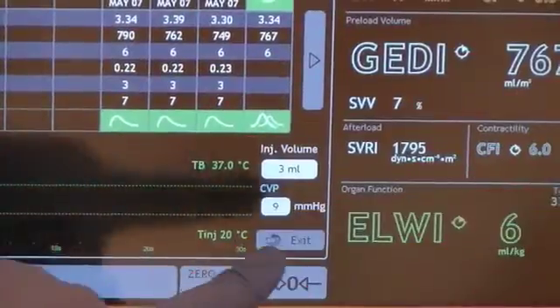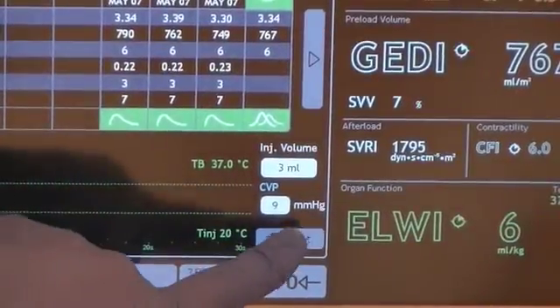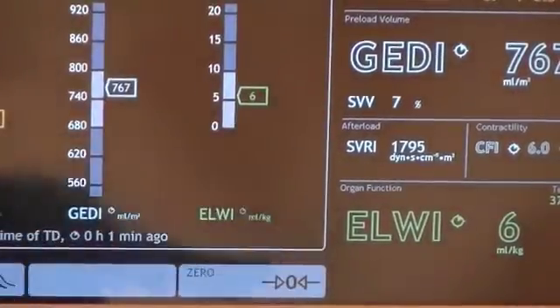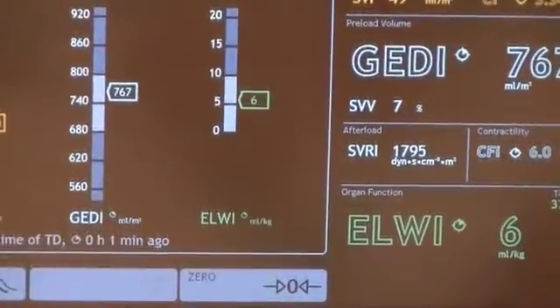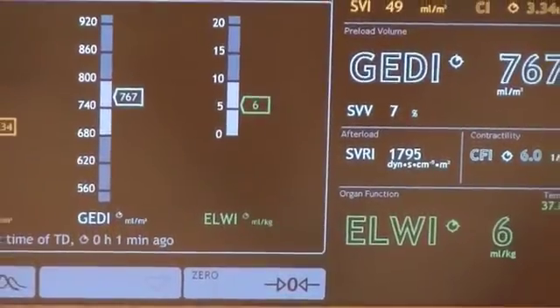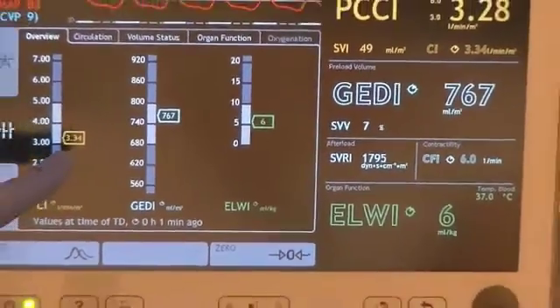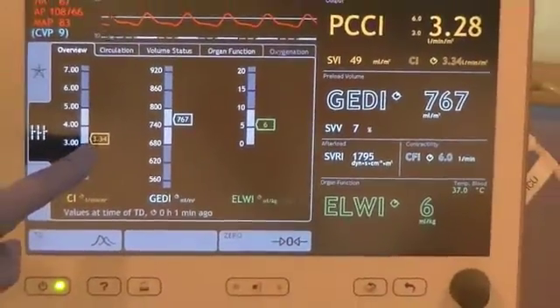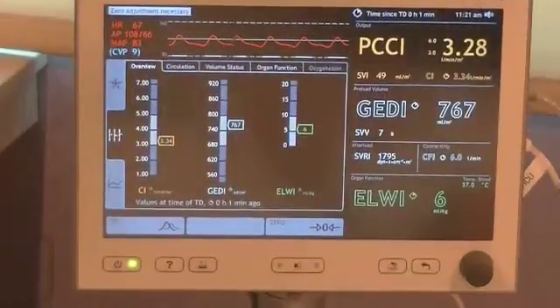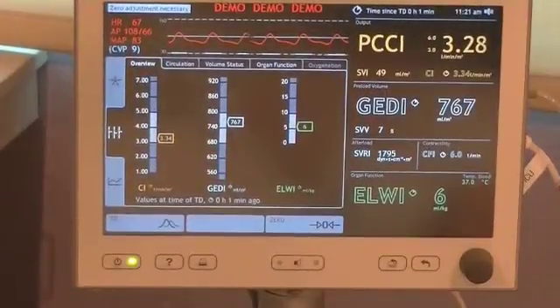Now, press the Exit key. The values are now displayed on this screen. You have now completed the thermodilution process with PICO2.